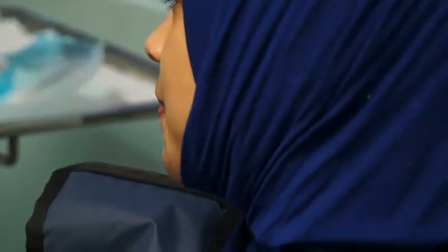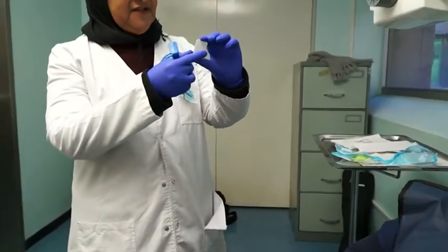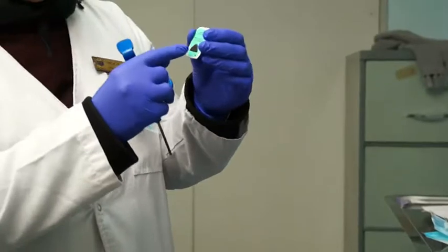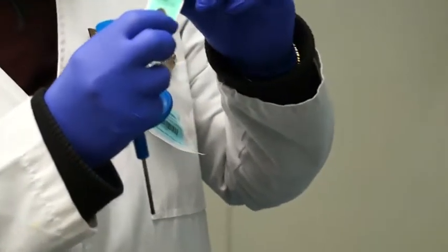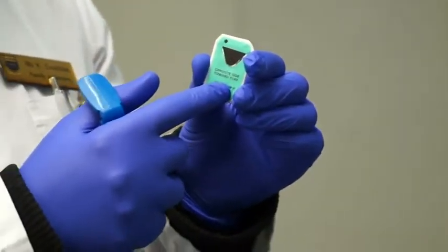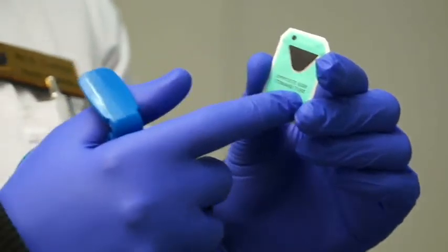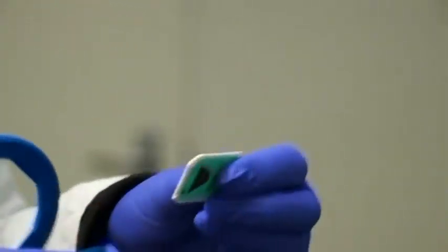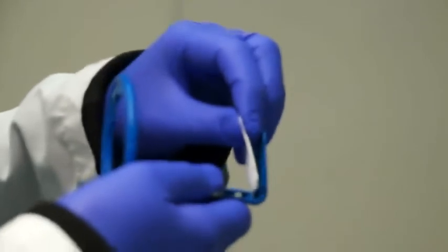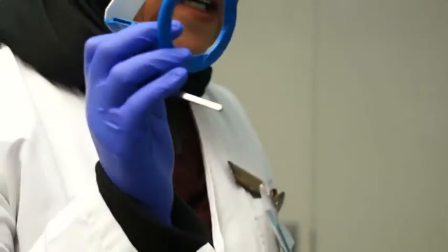This is my anterior film. The front of the film faces the patient and the back faces away. There is a small dot for identification purposes. This is an ultra-speed film, which means it's a slower film, so the exposure must be set for ultra-speed — usually 0.4 of a second. When positioning the film in the bite block, the plain side faces the X-ray tube, and we have the dot facing the occlusal surfaces so that any pathology does not interfere with the apices.